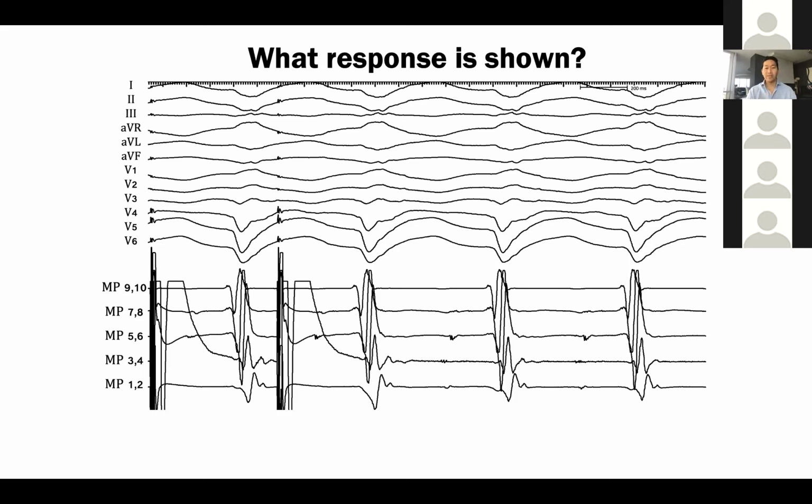Well, you explain that the activation actually doesn't even go from 3/4 to 5/6. That's a pseudo interval. We have this tendency that if one electrogram is earlier than the other one in EP, we draw an arrow from the earlier one to the later one. That's not the way it always works. It just means that's relatively earlier, but that could be a pseudo interval. It doesn't mean you have conduction between 3/4 and 5/6. So this is the perfect example in which 3/4 is a bystander and 5/6 is on the racetrack. It is on the circuit.